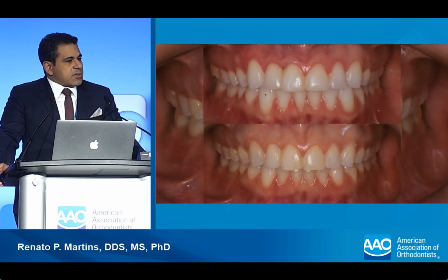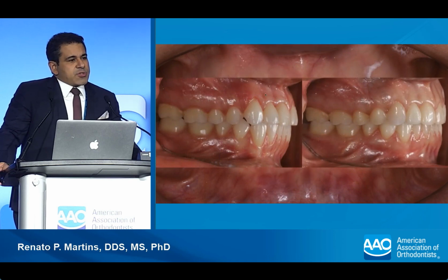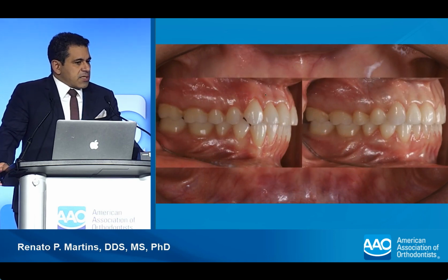And we can notice that only by proclination we close the bite a little bit. So there's no extrusion, there's no pure extrusion planned here. It's only relative. Here, of course, the correction is small, so you can see it very well.